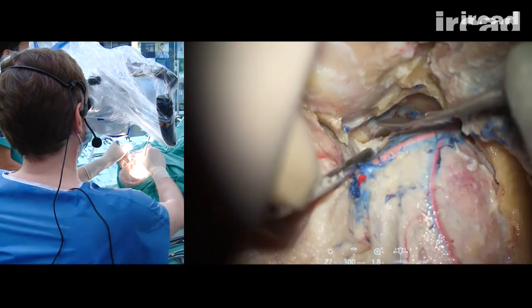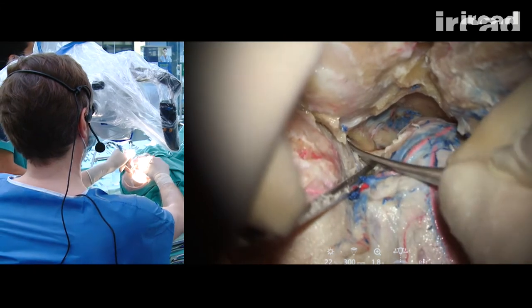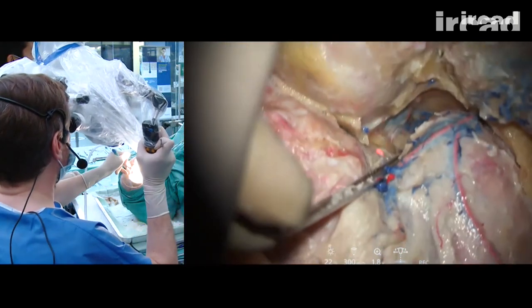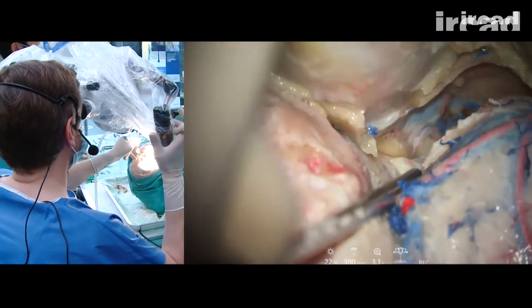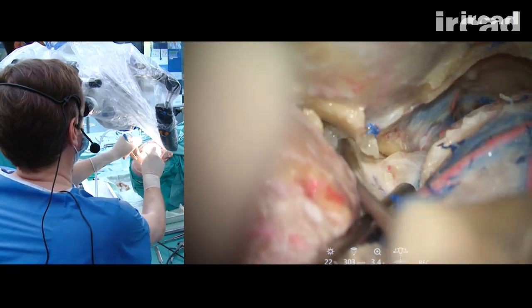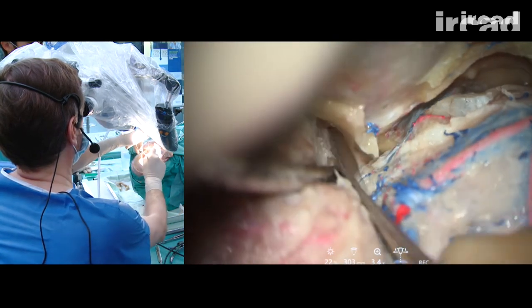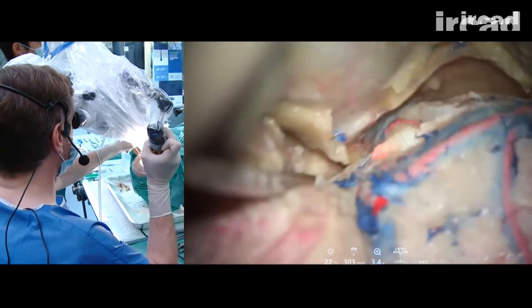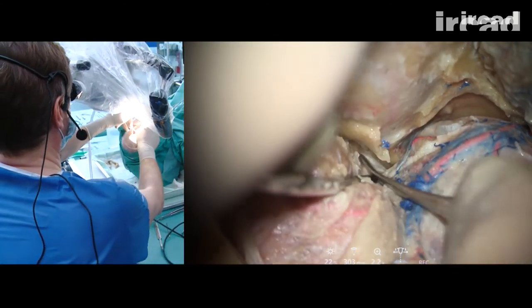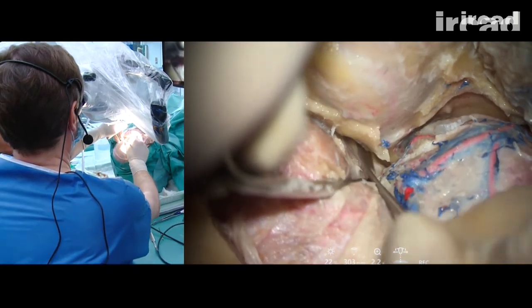And you can also see that I increase the exposure of the anterior clinoid process significantly. I can see here my anterior clinoid process. So if I am dealing with a cavernous sinus meningioma and I have to do an anterior clinoidectomy for this, it's better to peel the dura mater from the cavernous sinus first and then to do the clinoidectomy.